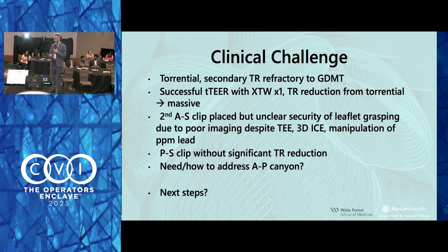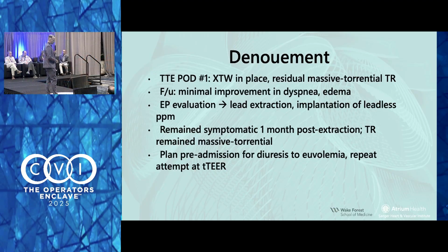Limited options. The other thing, was there atrial septal defect related to the Watchman? Anything you left behind? Not that needed to be closed. Not significant. Okay, so we decided just to stop. Good suggestion.